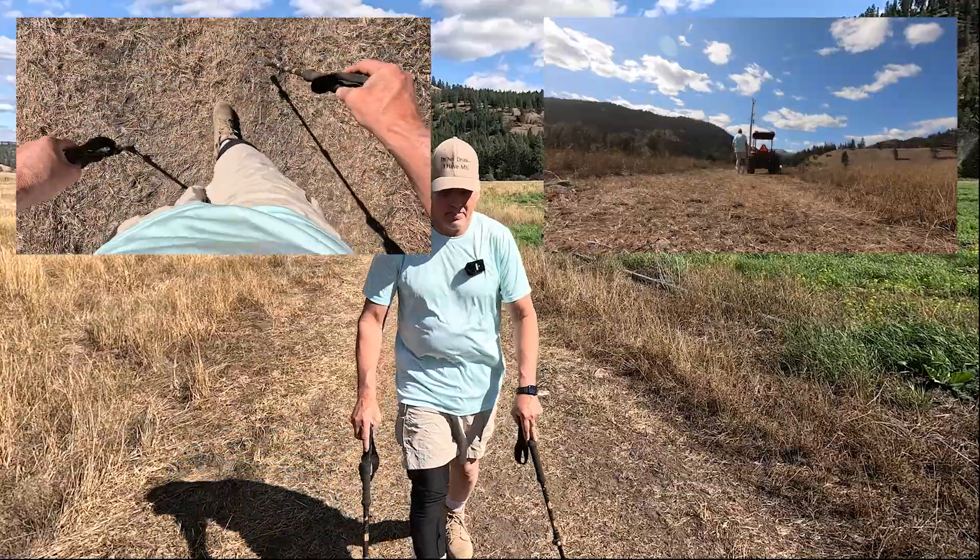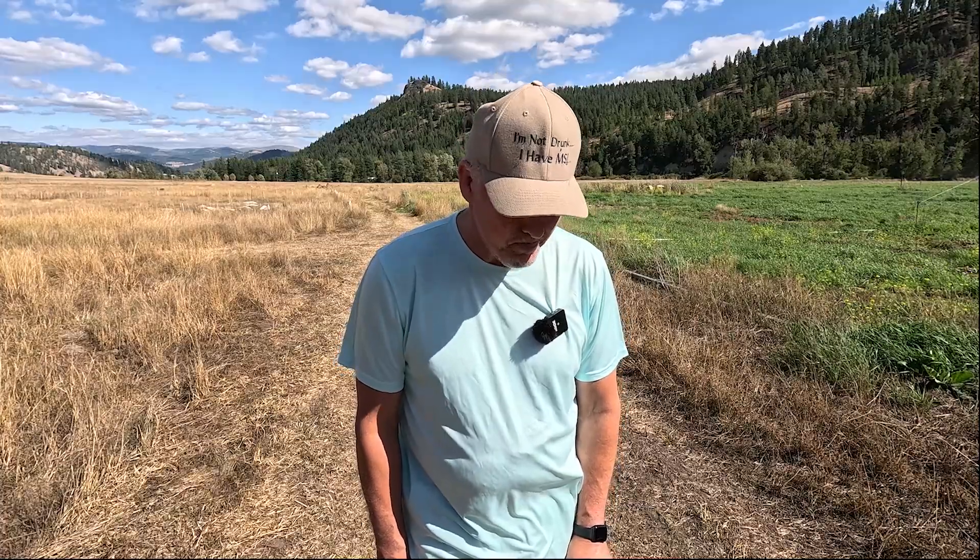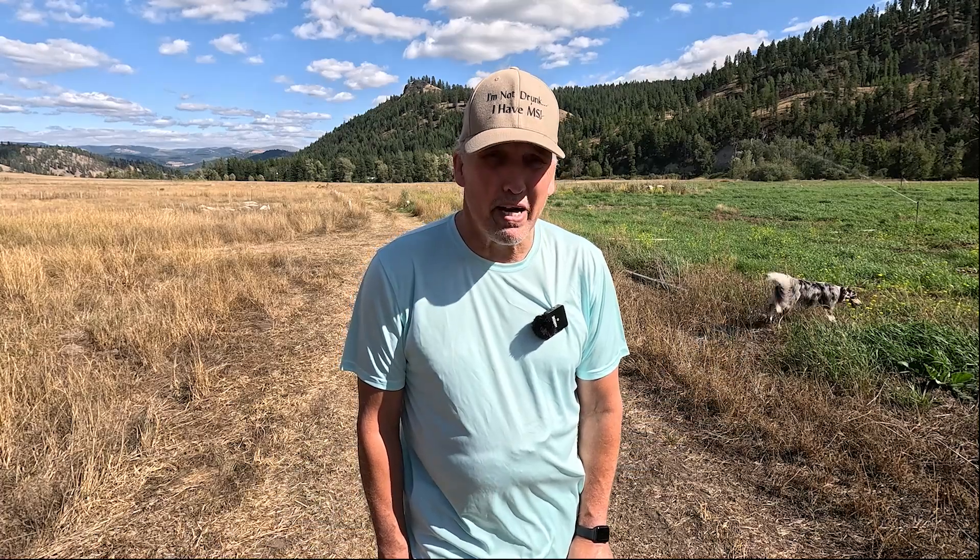I like that. When you first get set up with your sleeve, you will notice the tingling as it stimulates the muscles as you walk. But it may be 10 strides and it's gone — you don't even notice it, at least I don't. It's not uncomfortable. It's actually very comfortable as you're walking when you're getting back more towards a normal gait, rather than one with a lot of extra effort to get your foot to clear the ground. The other thing I like about the sleeve is, unlike my AFO — which is broken in pieces and heavy, even though it's carbon fiber — it is a lot heavier and a lot more uncomfortable to wear than the psionic neural sleeve.